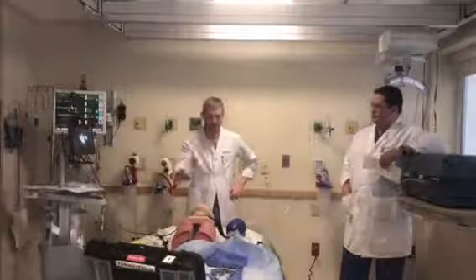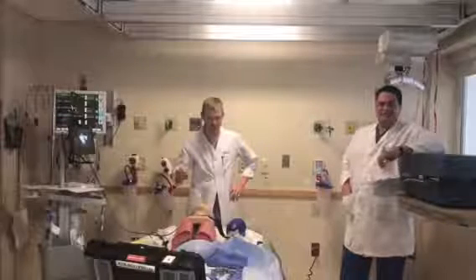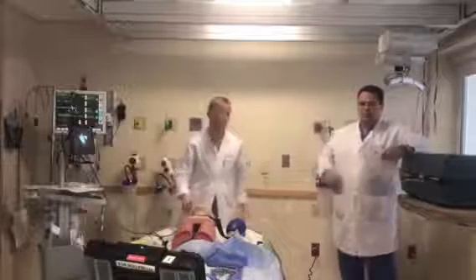So we can try, tick tock, tick tock, nasotracheal intubation. Thank you. All right, just shove the tube in the nose. We couldn't do it. Okay, next.